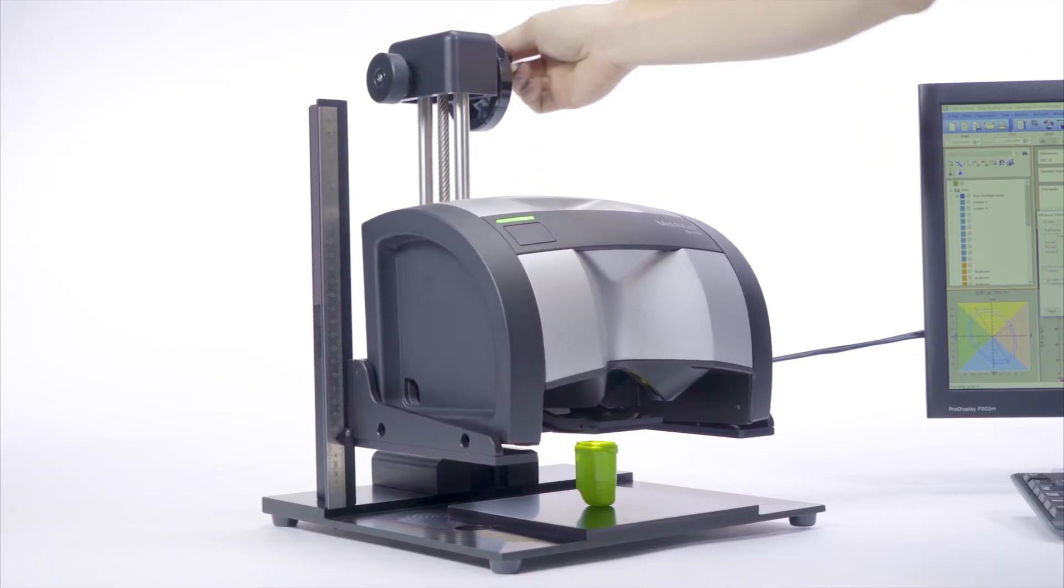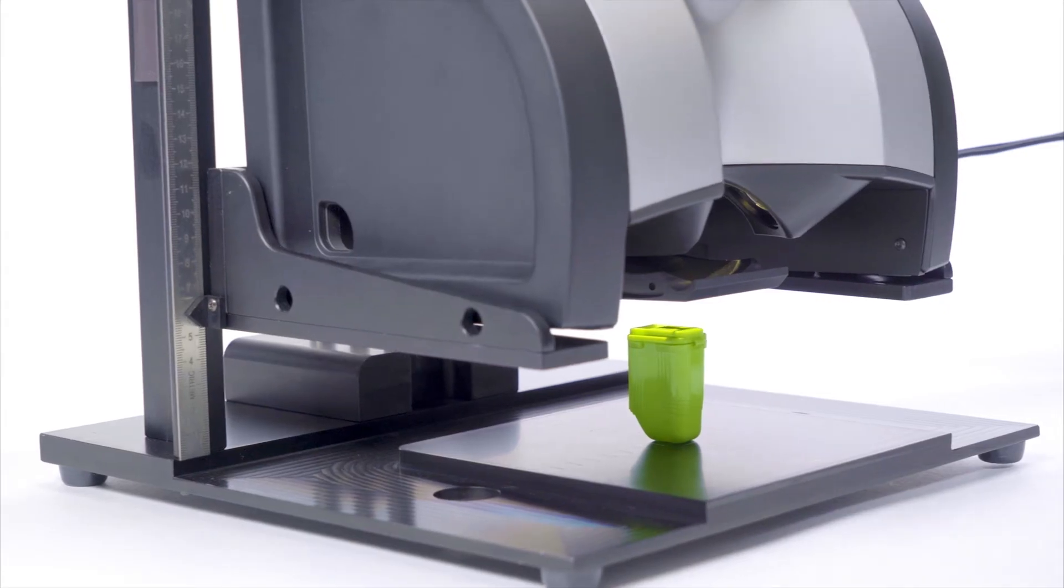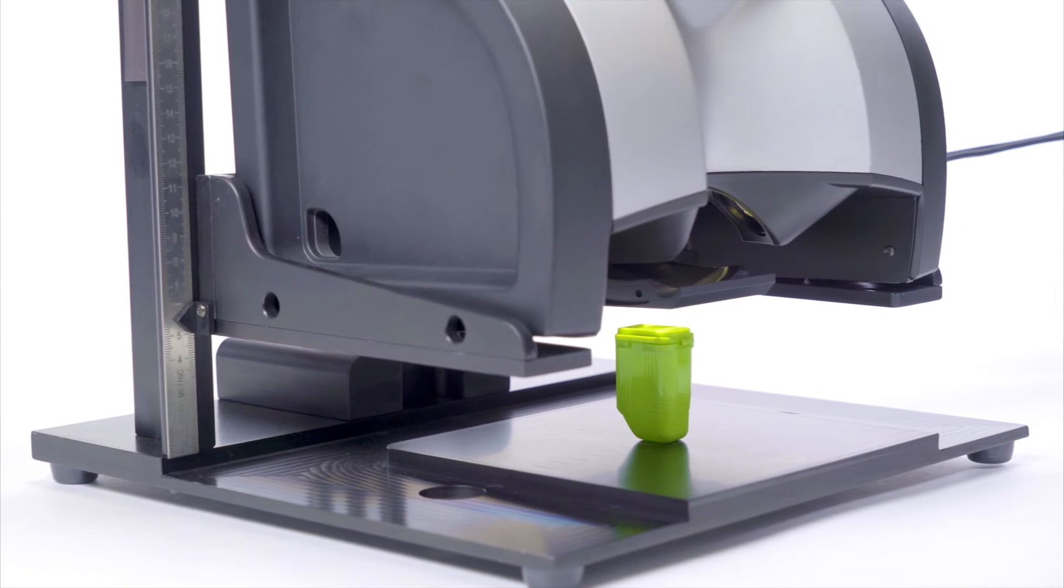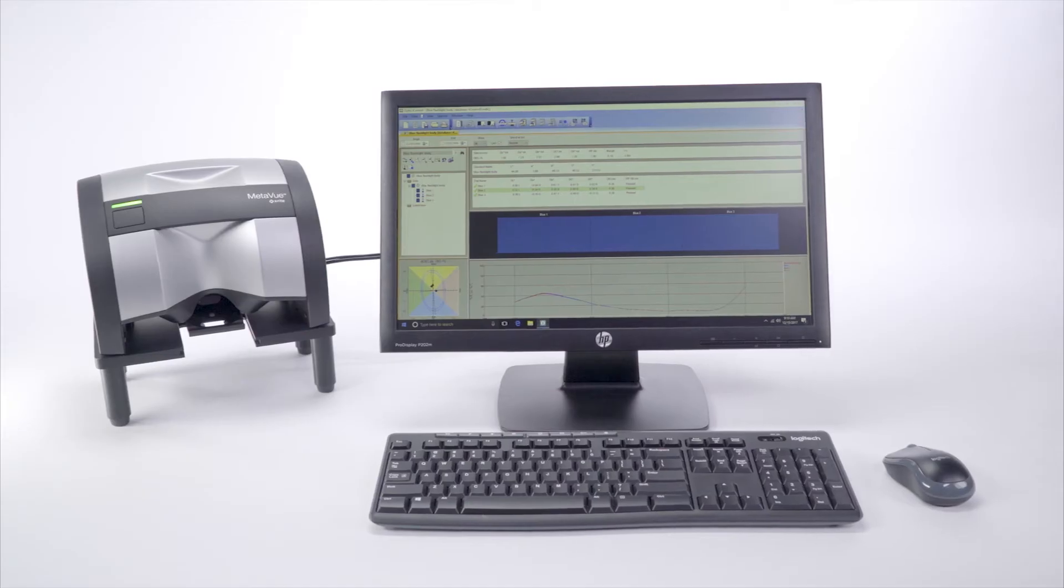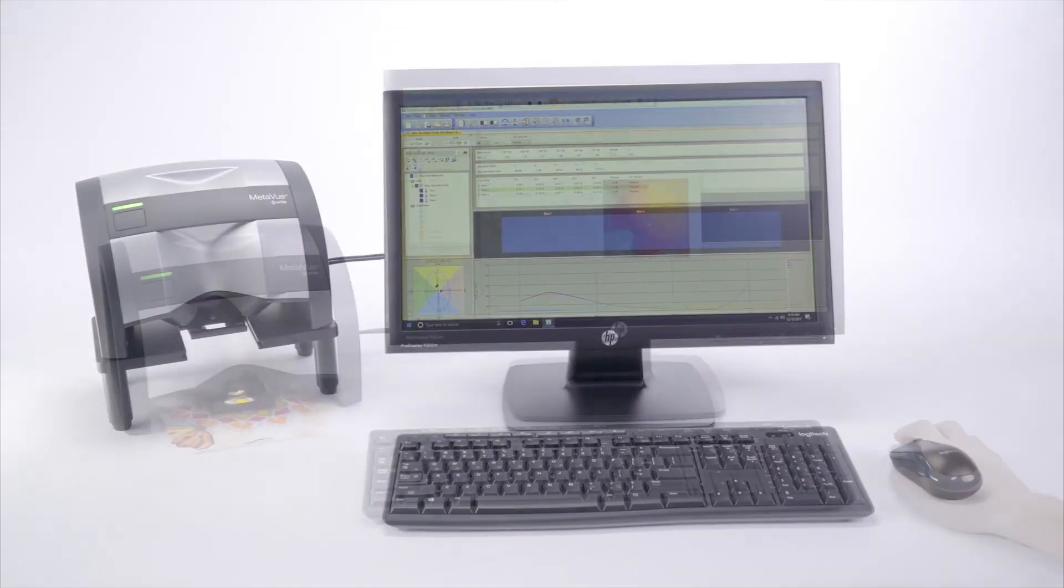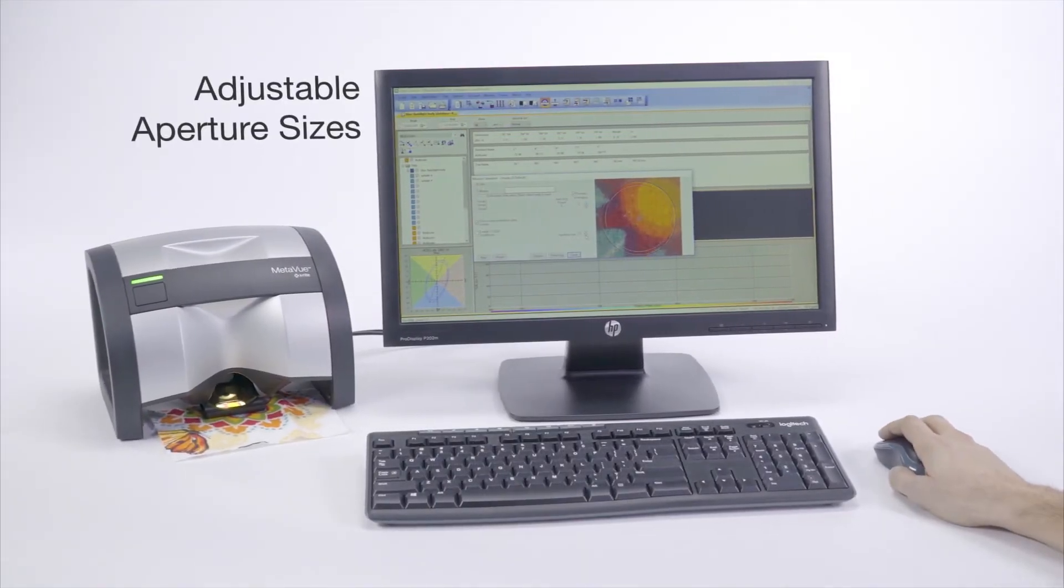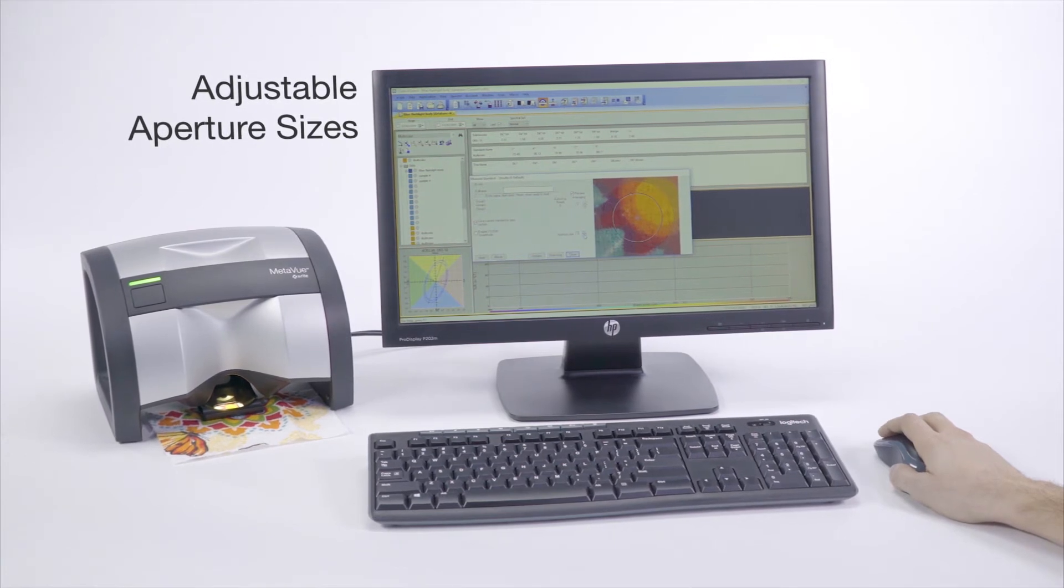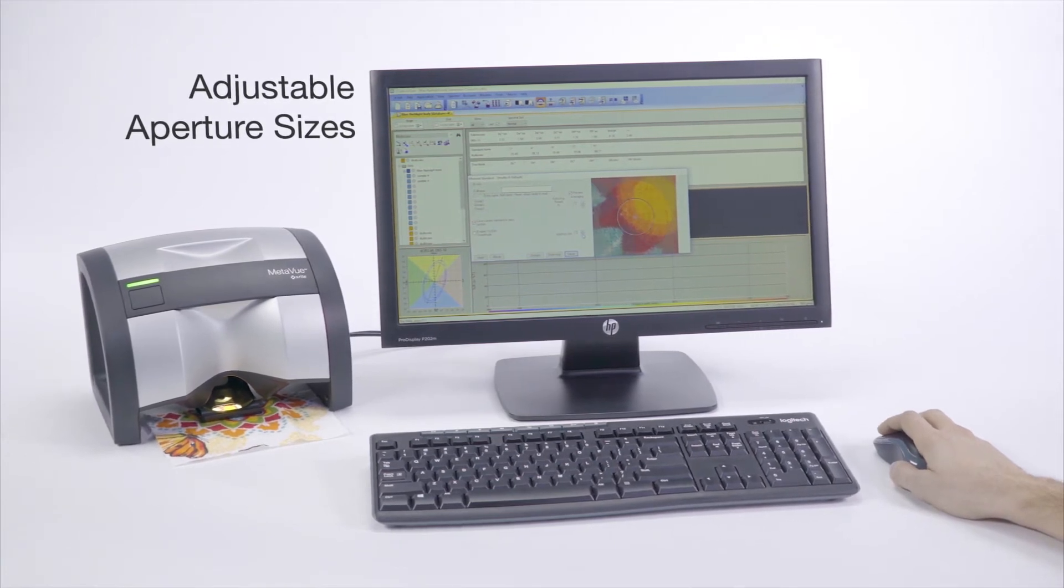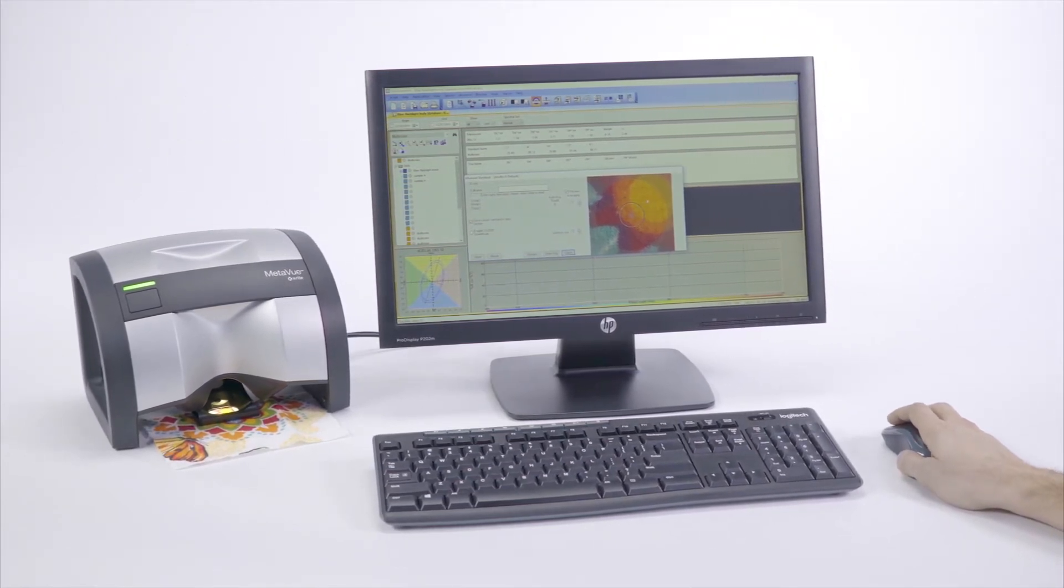MetaView makes it simple to accurately measure challenging samples such as odd-shaped items. It offers powerful software and adaptable accessories, including a range of adjustable aperture sizes for every job, from 2mm to 12mm.